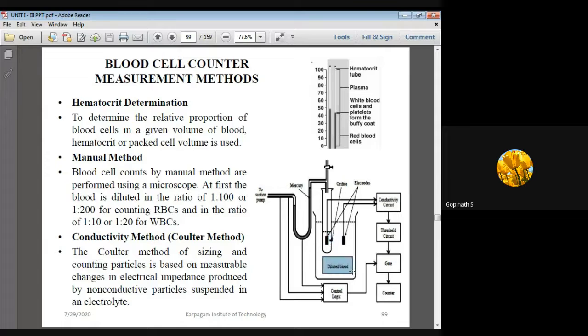Across this electrode, we are now applying the negative pressure. The blood content will penetrate towards the electrolyte solution, so both the electrolyte solution and blood content will be mixed. The conductivity of the diluted blood is lower than the electrolyte solution, so a voltage drop will occur across the electrode.